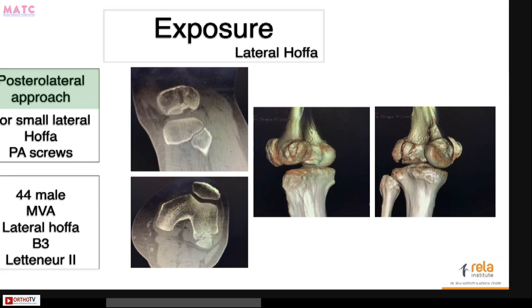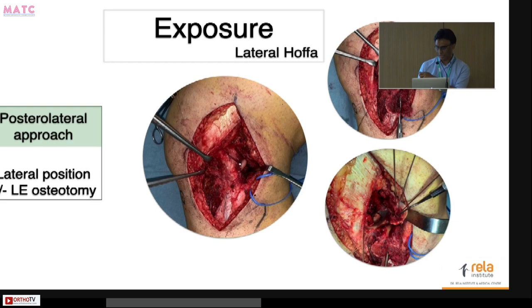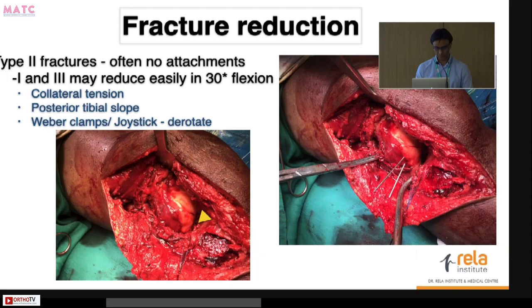This is another lateral OFA — again much more posterior — and there is also an intermediate fragment that is not well aligned, which can make reduction of the main fragment more complex. A similar strategy was used, but here a lateral epicondyle osteotomy was also performed to gain access. With the stabilizers in place, visualization was obstructed, so they were taken off. The intermediate fragment was then reduced, everything fixed, and the osteotomy was secured with either screws or a mini plate.